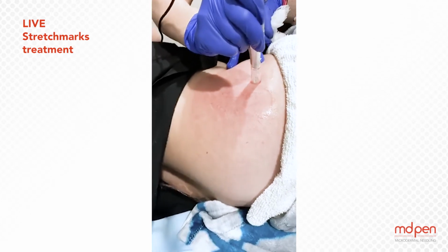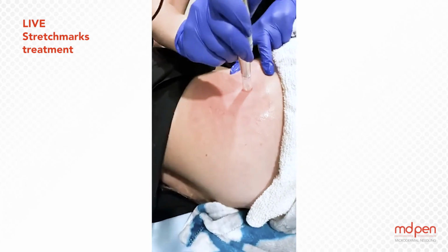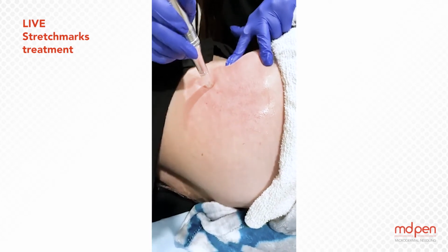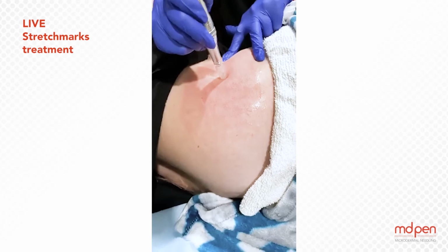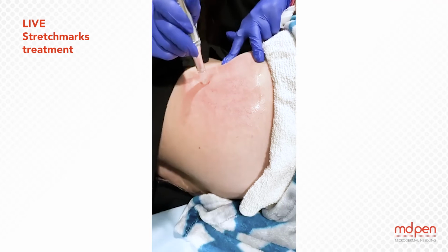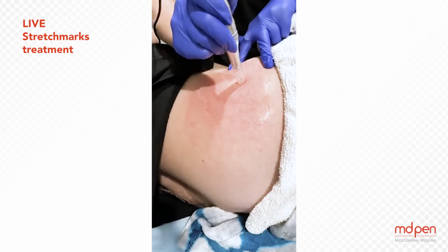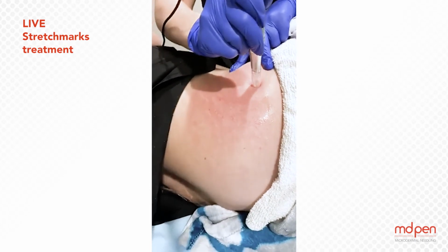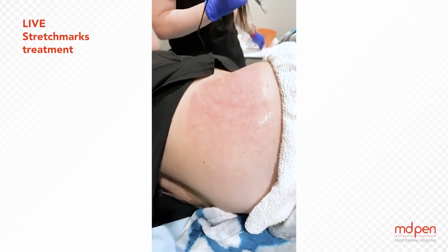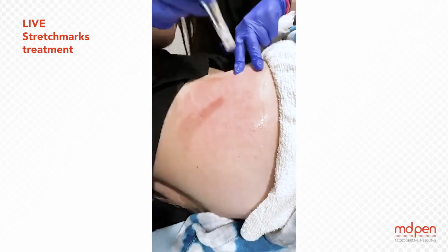How many needles are on the MDPen? So today I'm working with our Restore needle cartridge, which is going to be 12. And how many treatments do you recommend? Typically 8 to 12 when dealing with stretch marks. I would try to have them pay for a series of 6 up front and go from there. If you have someone that you cannot talk into buying that large of a bundle, they can pay as they go, but I would definitely let them know for maximum results what's needed.